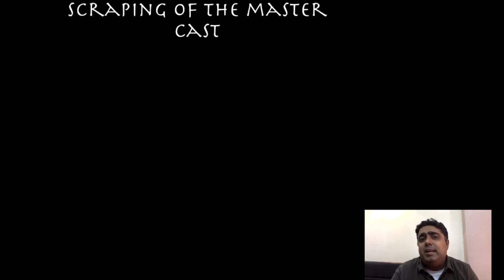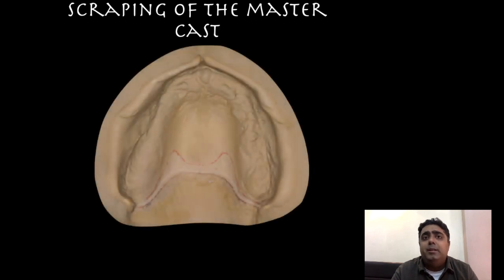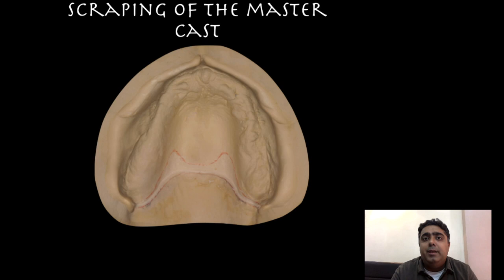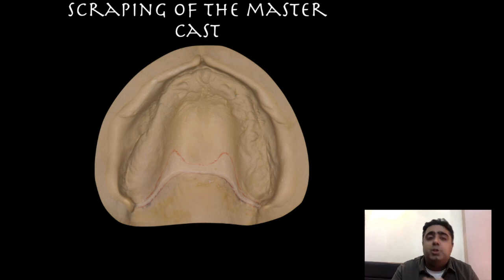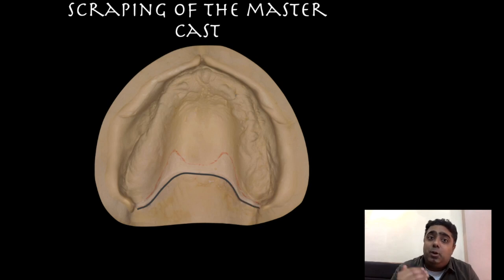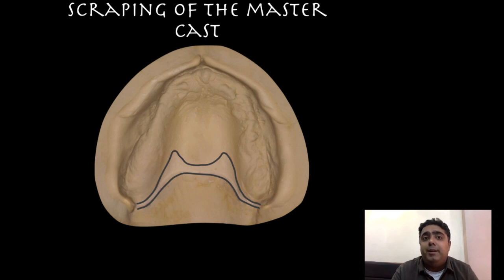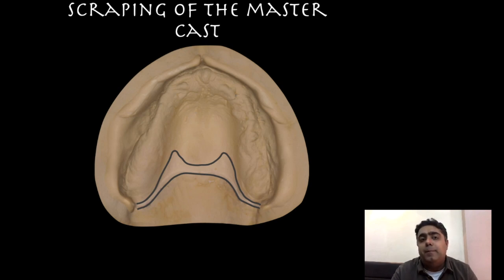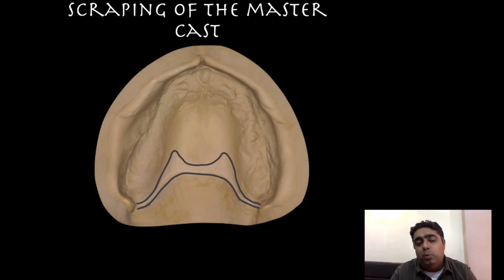Another way of creating the seal is scraping the master cast. I wouldn't recommend scraping it arbitrarily — it has to be a systematic approach. Locating the two vibrating lines carefully is even more crucial when the trial record base is found to be lacking retention. Marking it in the patient's mouth, rechecking, transferring it to the record base, and eventually onto the cast needs to be carefully repeated. The scraping should not be like a step at the borders but should flow gradually. One of the inherent disadvantages of the procedure is an overzealous approach leading to over post-damming.